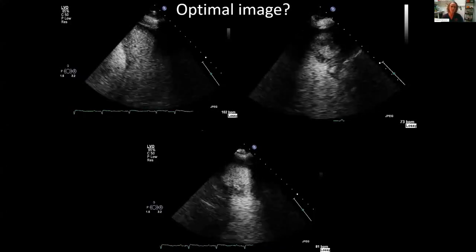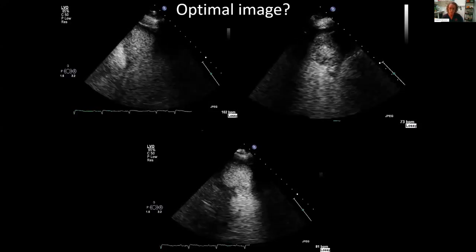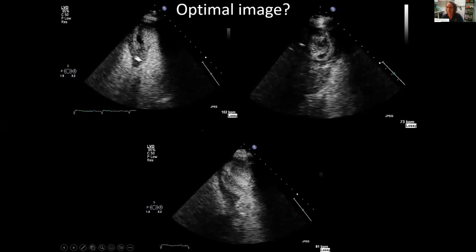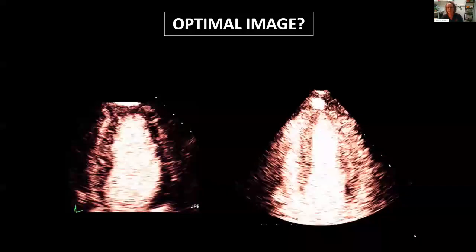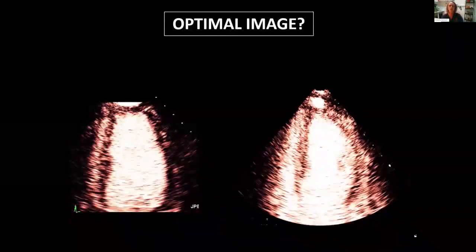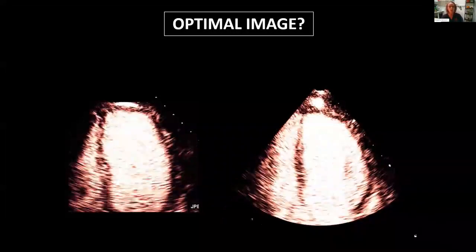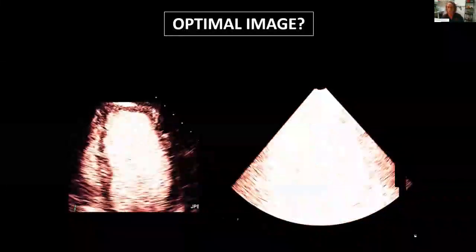which brings us to the point that giving contrast is not the be-all and end-all. We have to understand a little bit of the ultrasound physics, the bubble physics, and the machine physics, to understand how the bubbles and the machine interact with each other and how we can manipulate this in order to get good images.